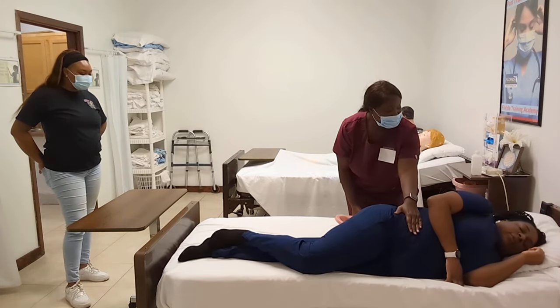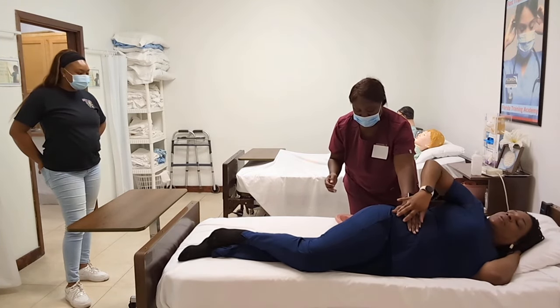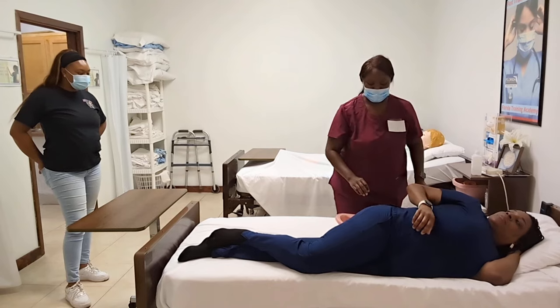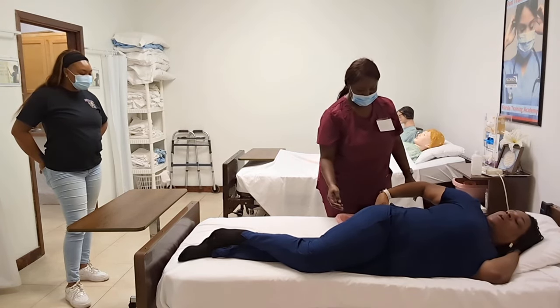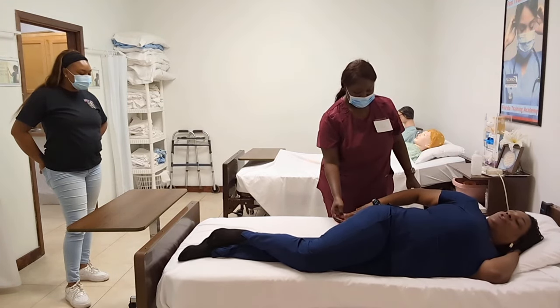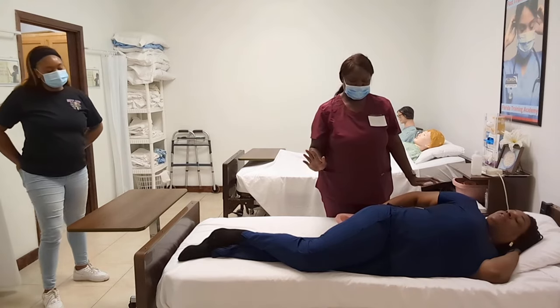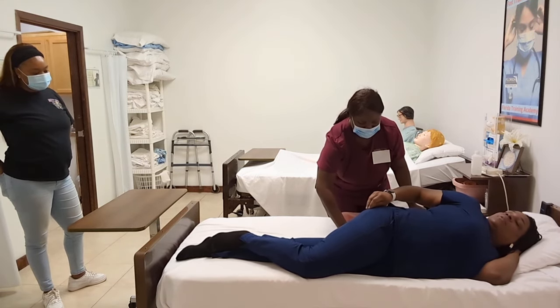Right. So which direction would you wipe me if you were in the real world? I'm going to wipe you back to front. It'd be front to back. Front to back, okay? And if you remove this too fast, you won't have a place to put your used toilet paper. Okay, so now if you'll just take this away for classroom purposes only, you can take it to the bathroom.